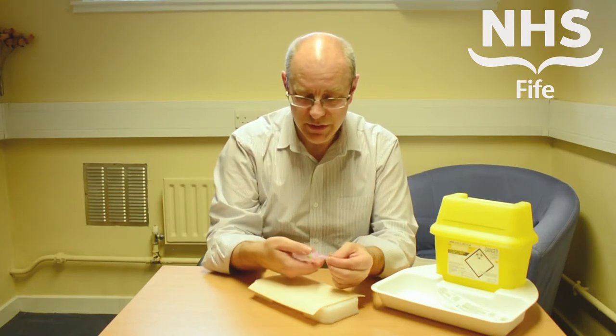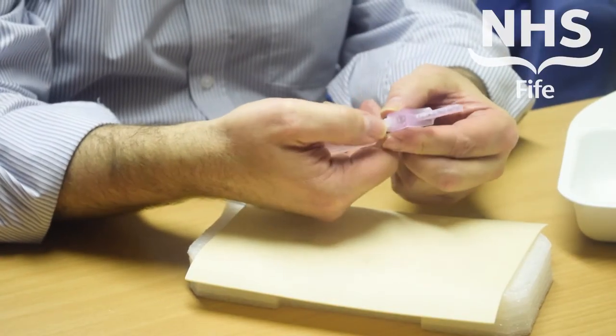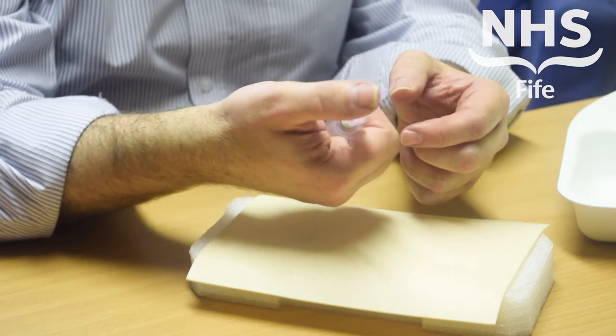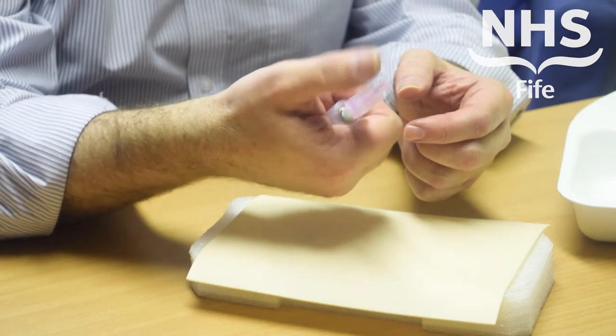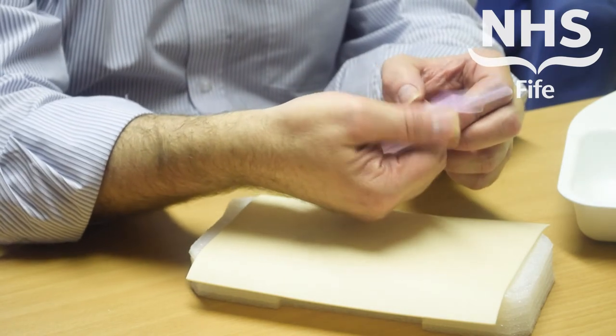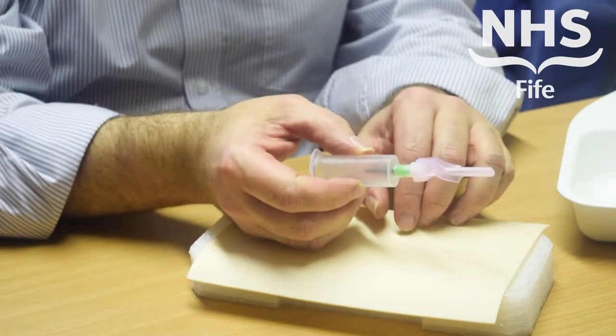A couple of points to note: make sure that you activate the device using the broad thumb part. Don't be tempted to push the sheath forward using the tip of the needle, because if your finger slips you're going to suffer a needle stick injury. At least if you're using the thumb part and your finger slips off, you're going to hit the shoulder of the needle, so no injury will occur.